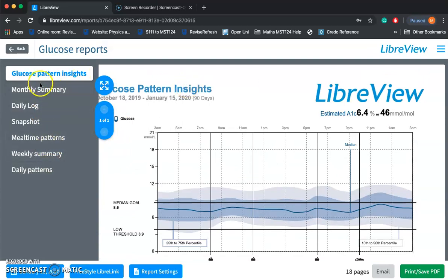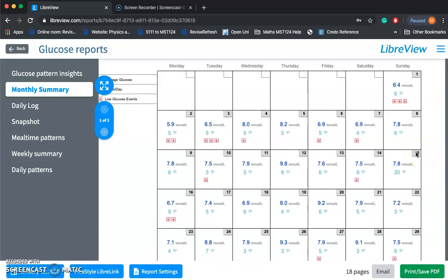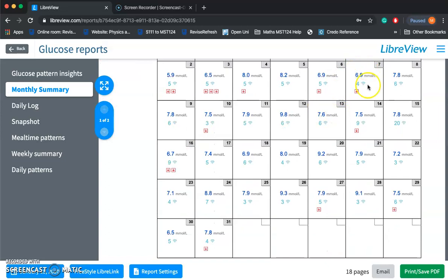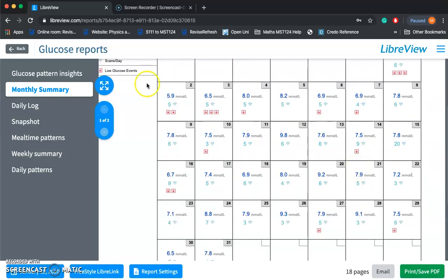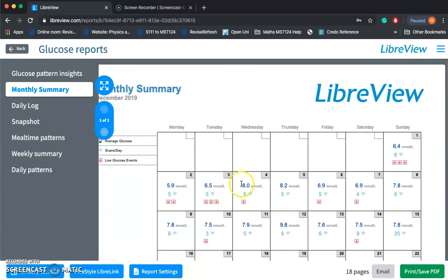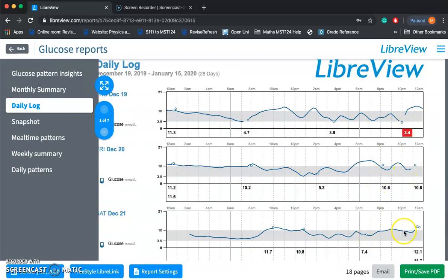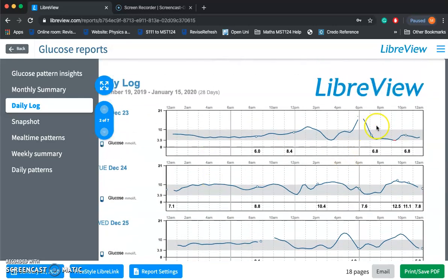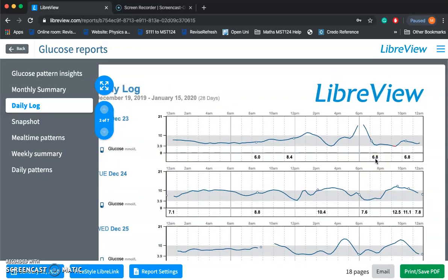Going down the menu, the Monthly Summary gives you a daily average glucose. Average glucose isn't always something to go by — a value of 5.9 could mean you've been hypo for half the day and high for the other half. But it's nice to see in the calendar view; for example, if you're always high on Saturday at 11, you can think about what you're doing on Saturday. The Daily Log gives you a daily graph where you can visually see trends — my blood sugar goes high at certain points, and I can see that pretty much every night it rises, confirming what the overall graph showed.